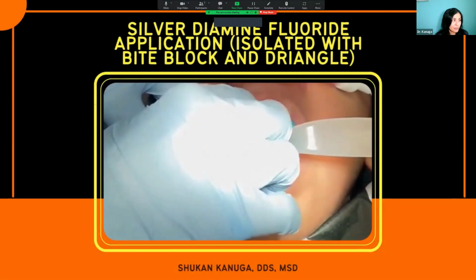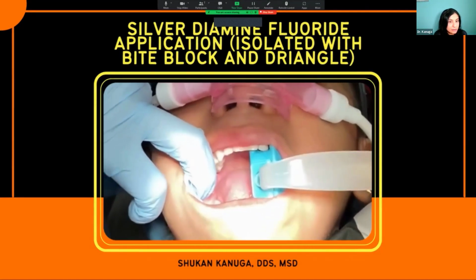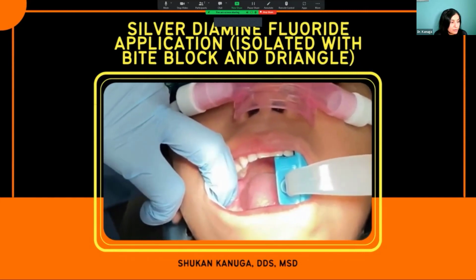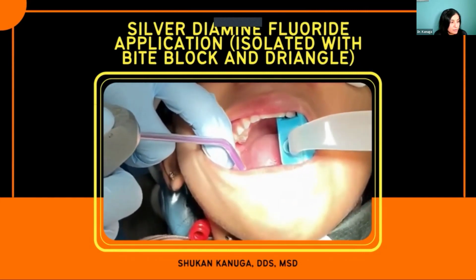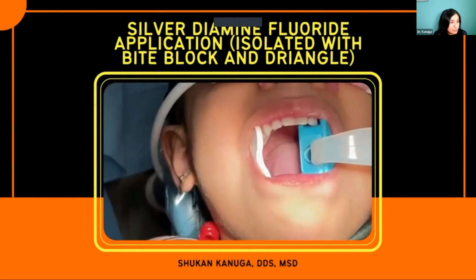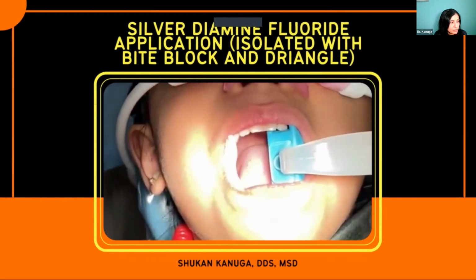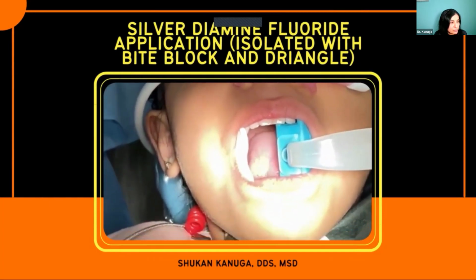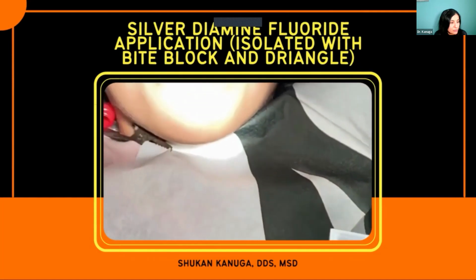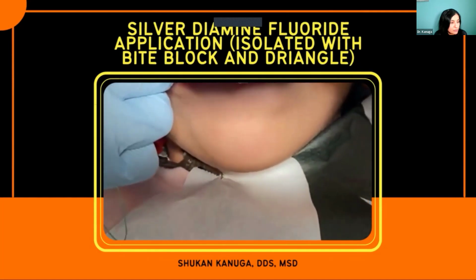Cheek pad. I'm going to put this cheek pad right here. I'm going to blow some wind now. Here, a little bit of wind like that. One wind right here, and a little wind on the bottom. And this is my floss, okay? Magic, look what I'm going to do. I'm going to make part of the floss blue. How cool is that, right? And then we're going to floss with this blue floss on the top.